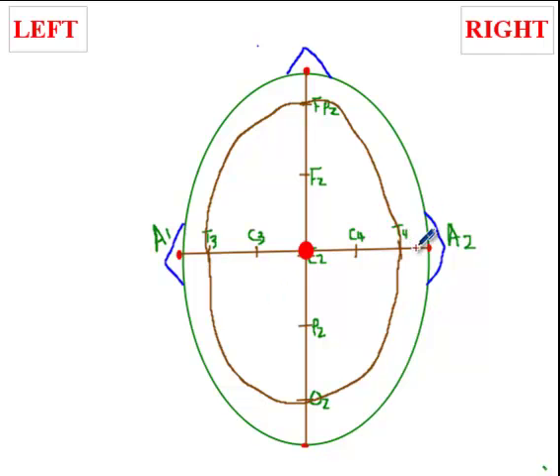Now, you've bisected this line, which you had drawn between the preauricular points. So, this confirms the position of T4 and T3. So, let's put some electrodes there.